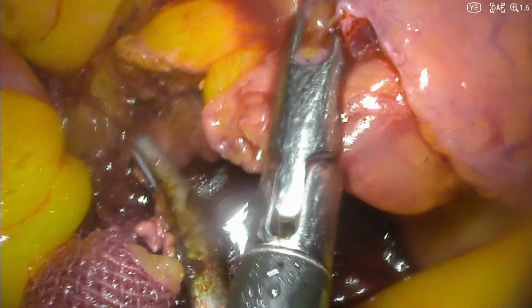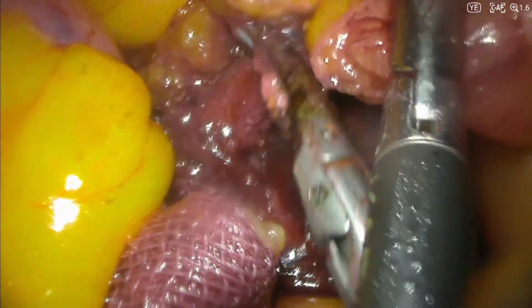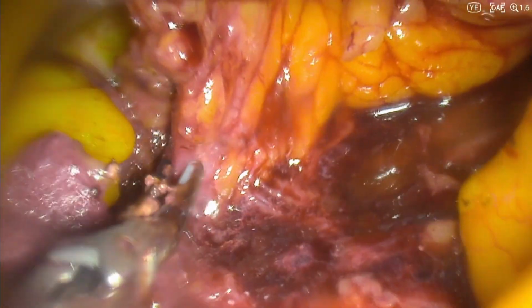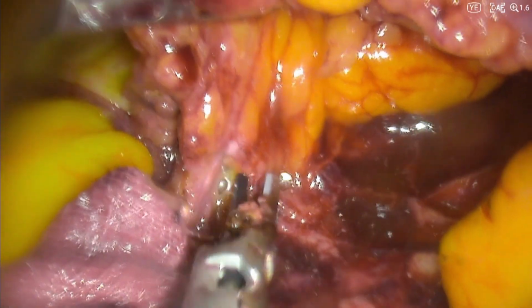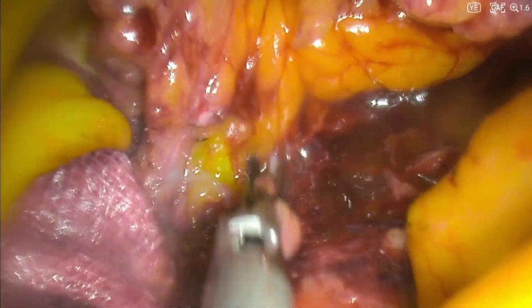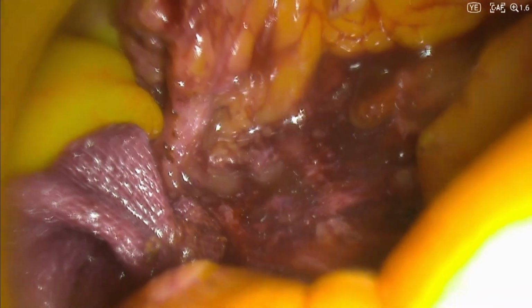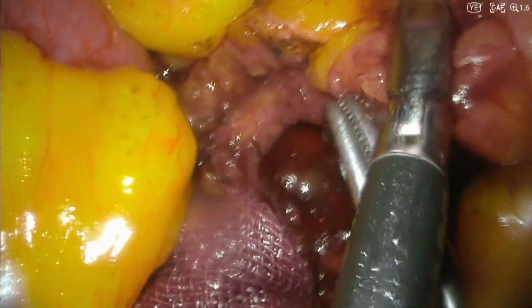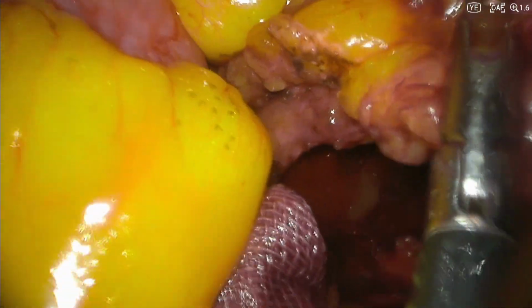This early identification of non-adipose tissue from adiposity prevents accidental injury to critical structures like vascular pedicles, which can happen more in obese patients compared to non-obese patients. While it is again possible to trace the inferior mesenteric artery and clip it without yellow enhancement, the contrast between the vessel and the surrounding fat tissue is not as strong and would appear under white light similar to each other, as in a general pale appearance. The yellow enhancement allows clear demarcation of the artery and enabled precise skeletonization and ligation.